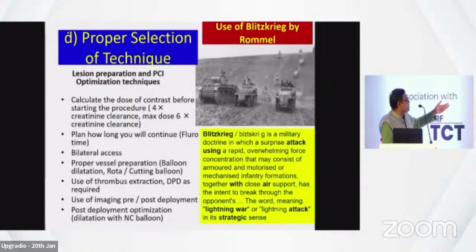Also, how long are you going to do fluoro? There are cases where fluoro has been given so much that burns have happened to the patients. So also remember these things are important. Then sometimes in CTOs you take bilateral access to know the retrograde part of the artery.